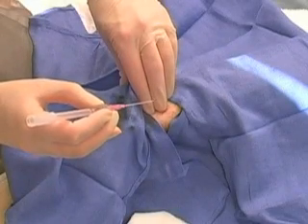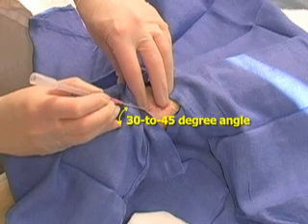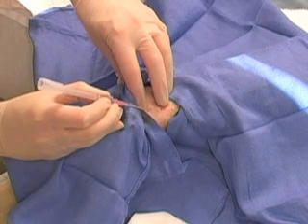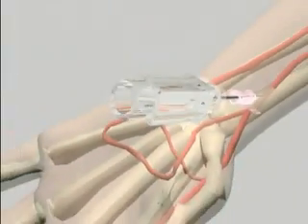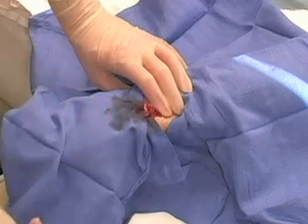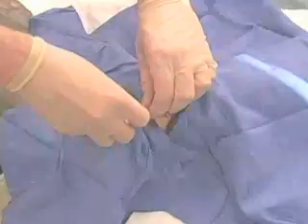In the over-the-needle technique, an angiocath is used and advanced at a similar 30 to 45 degree angle. Once blood return is obtained, the needle is advanced slightly farther to assure that the catheter has entered the vessel. The needle angle is then lowered to 10 to 15 degrees and the catheter is advanced into the vessel. Proximal pressure is applied to the artery and the needle can then be removed and the catheter can be connected to the transducer system.